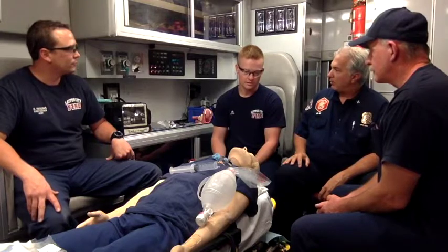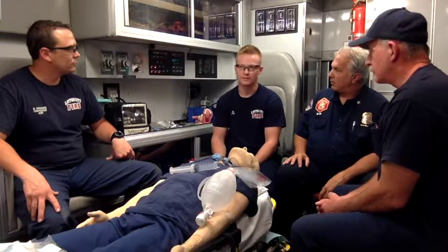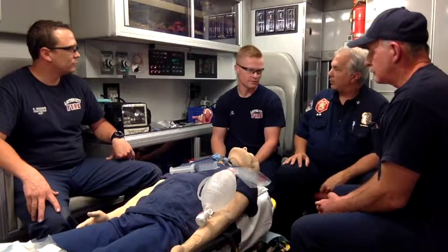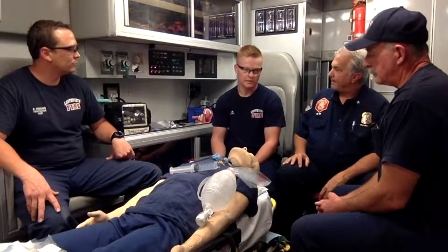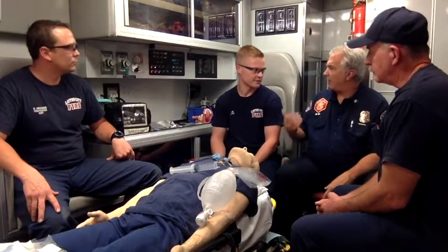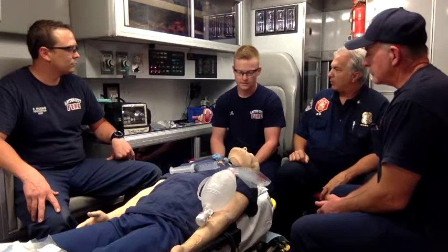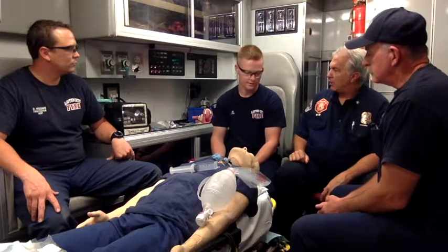Height under 4 feet is a contraindication. Okay. We talked a little bit about esophageal diseases, like varices or something. Sometimes that's hard to know, though, right? If they've got a known history, or if it's relayed by family or somebody, then you've got to know. Right, and then I can't remember any of the other ones.